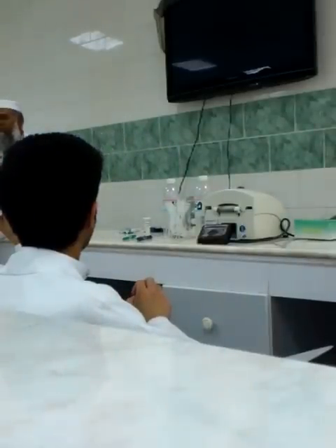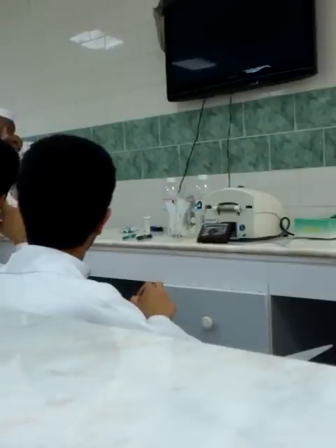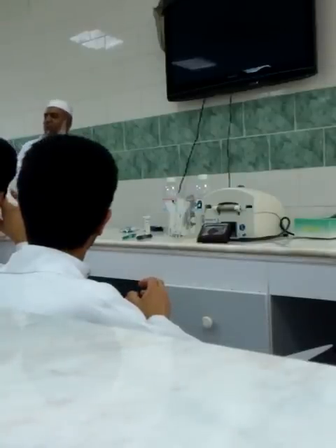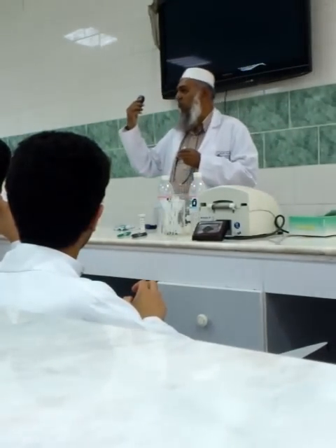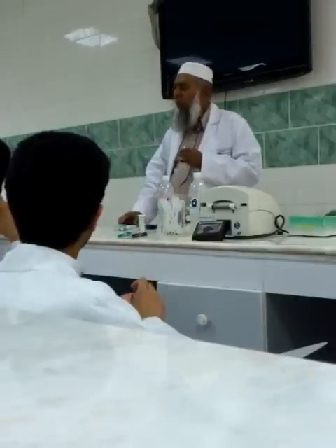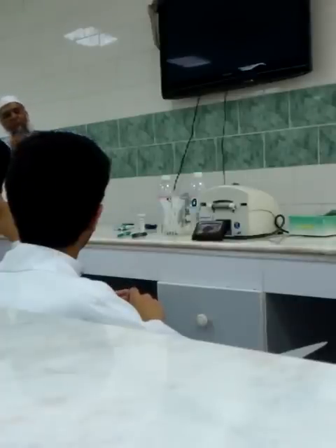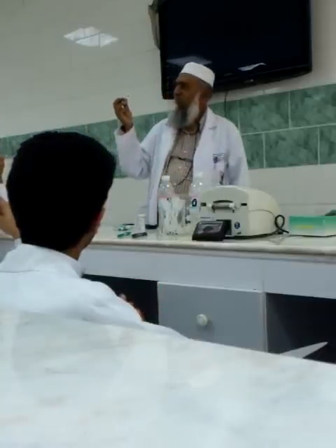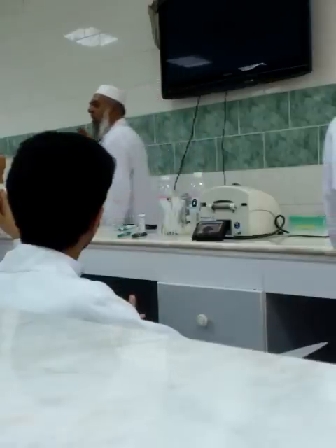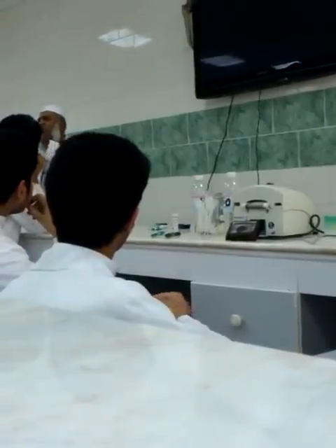What will happen is that when you put the drop of blood here on the colored area, a chemical reaction takes place and the screen will give you the value of glucose. As a result of this chemical reaction, the backside yellow circular area changes color from yellow to green, dark green, reddish, orangish, any color, depending upon glucose level.